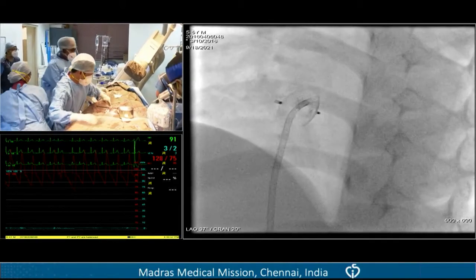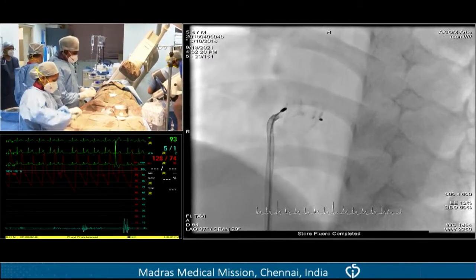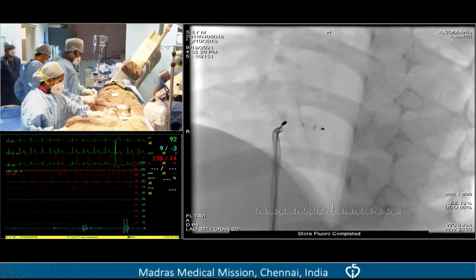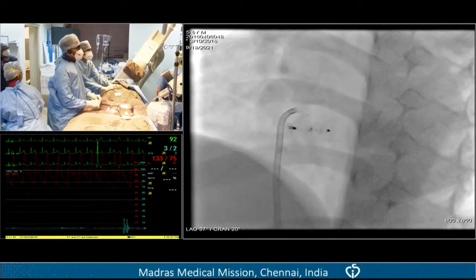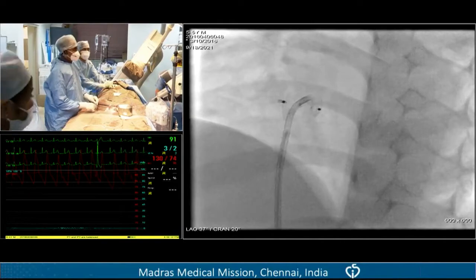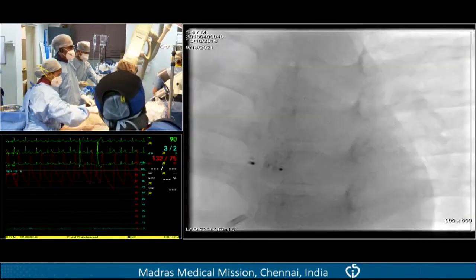Super. Okay. Now, sister, get me one. Set an injection for a PA angiogram levo phase. No rush, but you've got 1 minute. Come to AP, Shiva? Yeah, Shiva? Nice job. Nice job.